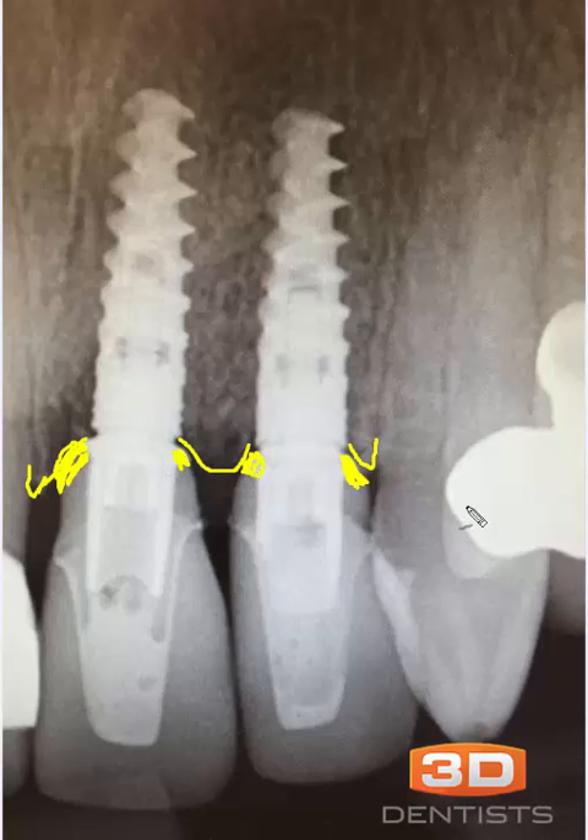What I would rather see us do in this situation is have a custom abutment made or modify this abutment. What I'd like to see in a case like this — as we can see the outline of our abutment right here — is have our abutment emerge like that. I would rather see the purplish line as our abutment emergence versus the actual green. This would give us more volume for tissue and more volume to maintain the bone.